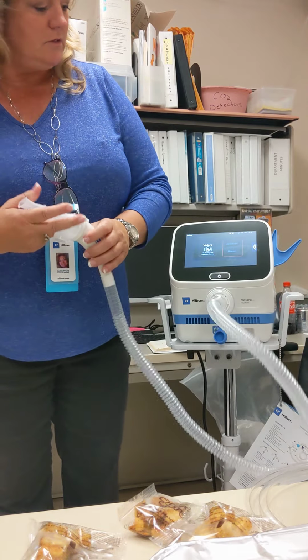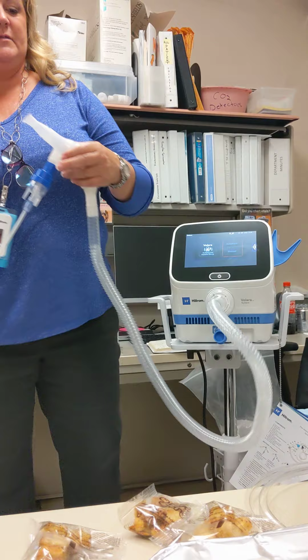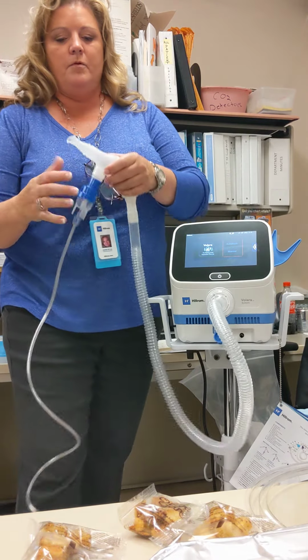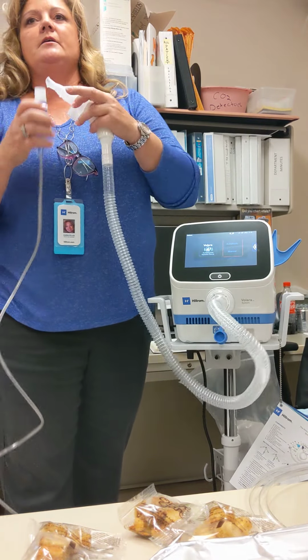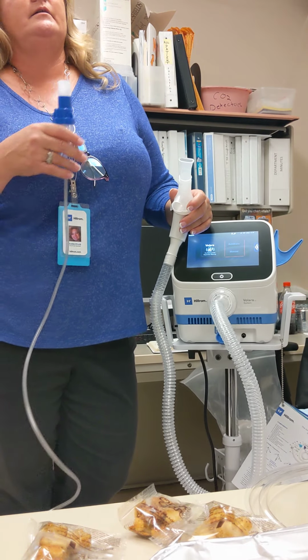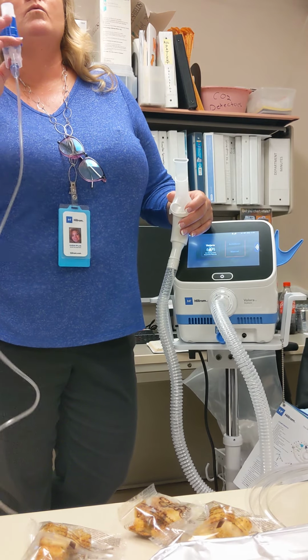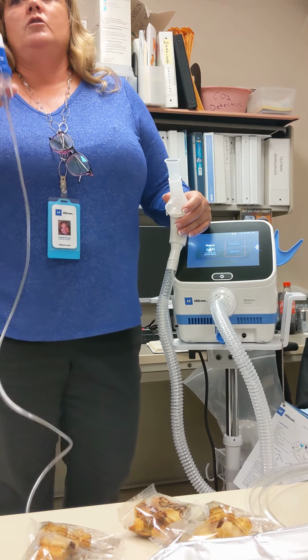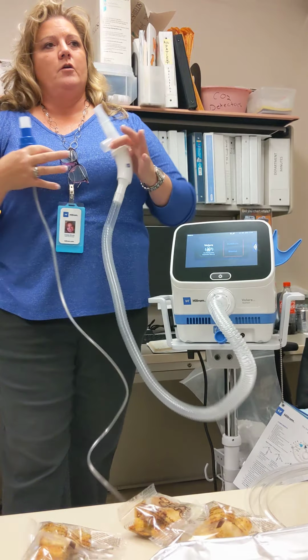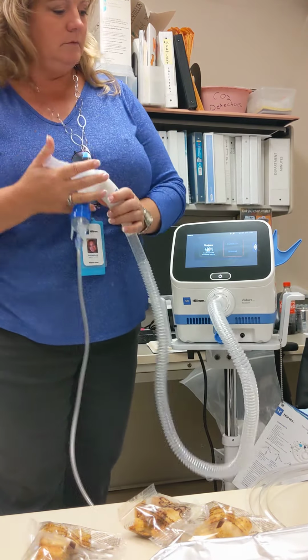Okay? So I have a spontaneous breather. I go off the wall. I drop my nebs in here. I do not put antibiotics in here. I put hypertonic saline, albuterol, but no antibiotics. You do that after the treatment. We're trying to open up the airway. Do it after. Cool?